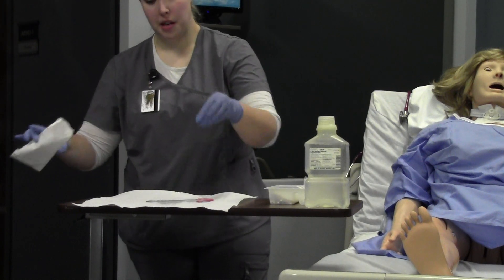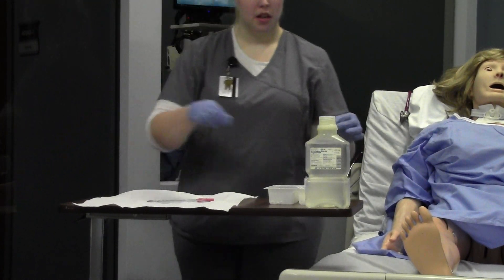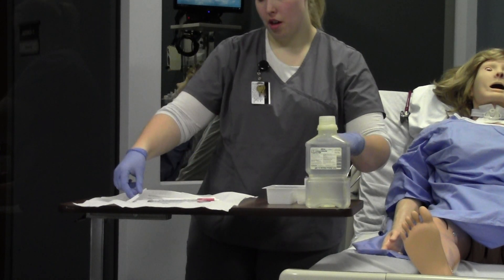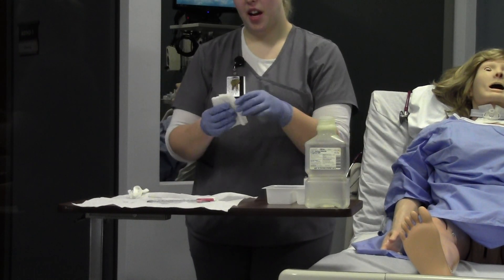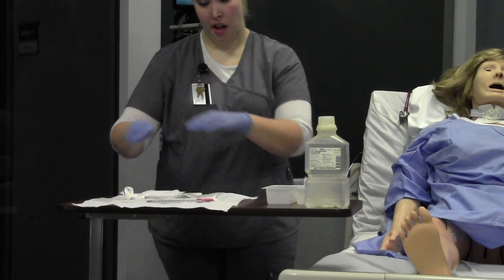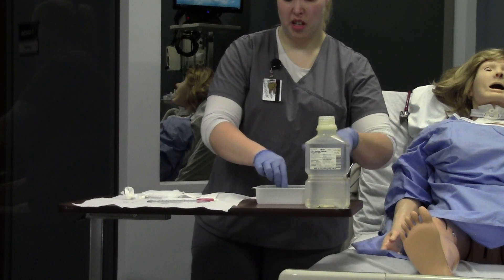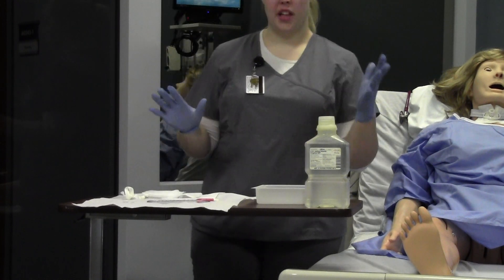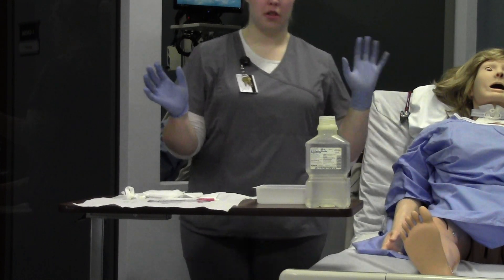Set your catheter down on the sterile field. You'll have two extra pairs of gloves, Q-tips, a brush, pipe cleaners, ties, a trach dressing, and gauze. Make sure nothing is on your one-inch border. Set everything up in the order you're going to use it. This is your dominant hand, which will remain sterile. This is your non-dominant hand, which you will use to do non-sterile things — remember that.